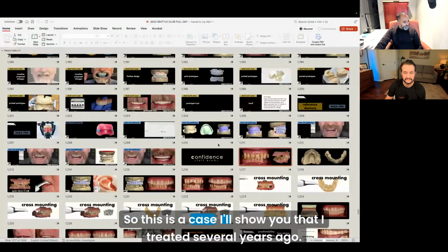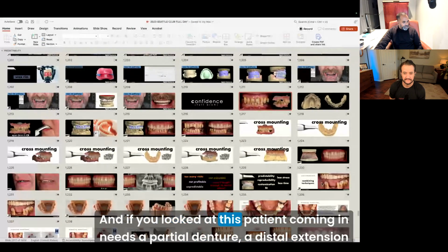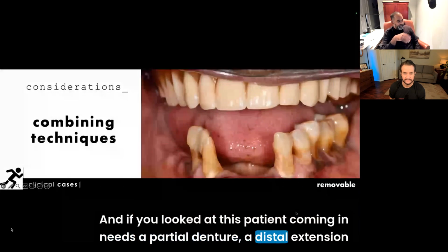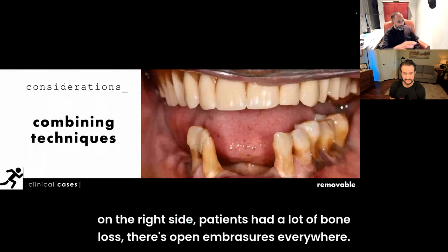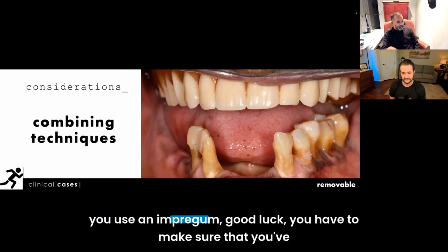So this is a case that I treated several years ago. If you looked at this patient coming in, needs a partial denture, a distal extension on the right side. Patient's had a lot of bone loss. There's open embrasures everywhere. And if you think about treating this case analog and taking a physical impression, if you use an impregum, good luck.